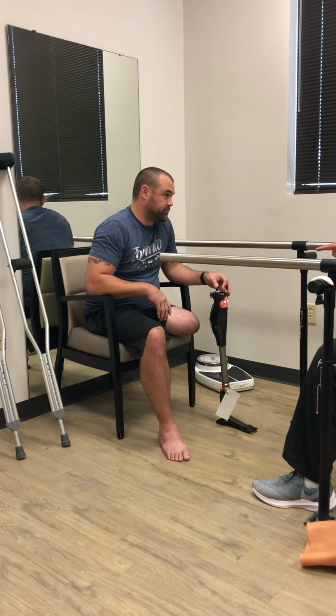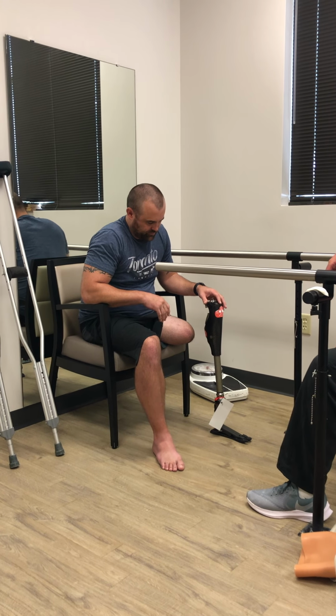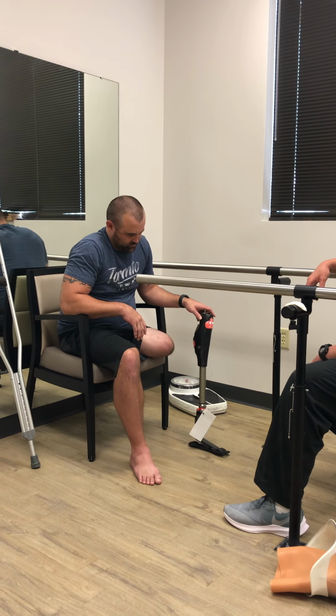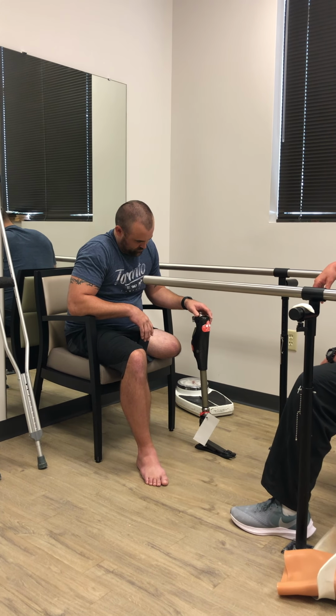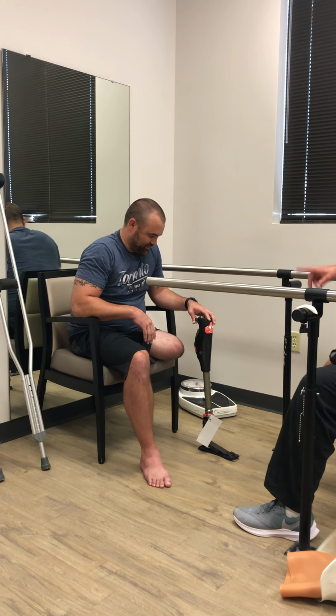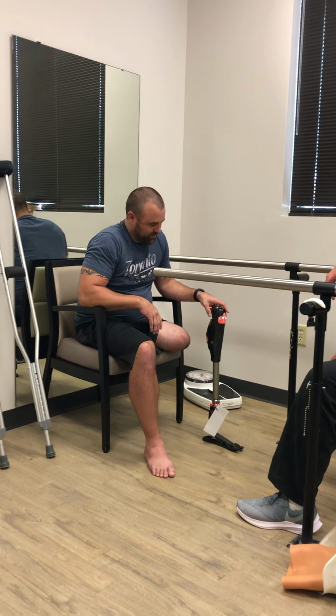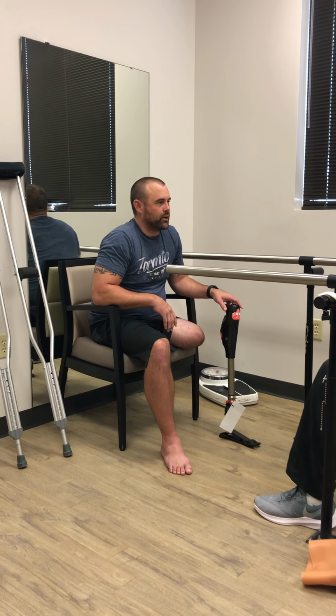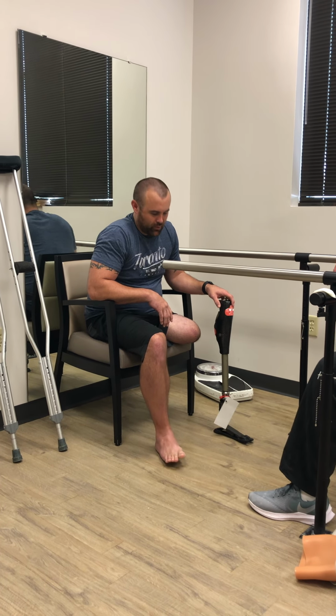I wish they would make the pylons black, because with the black and the carbon foot, it would look really tight. But they always make those pylons like that. I've asked them, but so far I think it's because they can't get the adjustment scale on the front to show up. You can only do it in white.